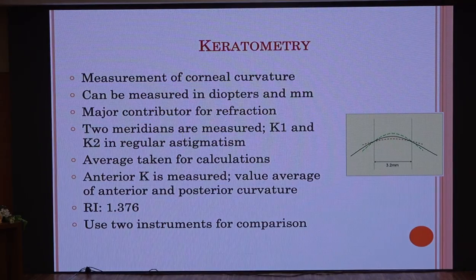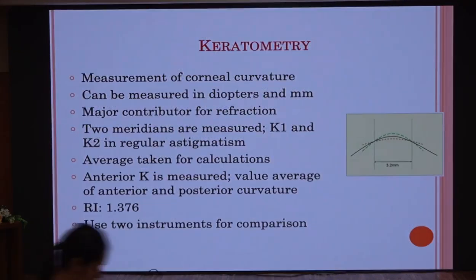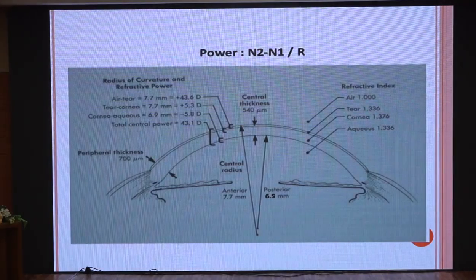So most of the keratometers, whether it's optical based or manual keratometers, they are giving us the SIM-K, meaning simulated keratometry values, and they are not calculating the posterior corneal values. So these are some of the parameters for the cornea which we see, that we have to look at the anterior surface which covers a good tear film. So if the tear film is not good, sometimes we may not be able to get the accurate keratometry. So patients sometimes, if they have dry eye, we need to treat them for a few days and only then have the proper keratometry.